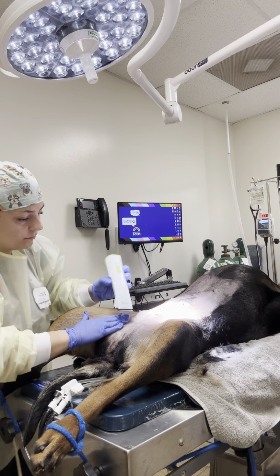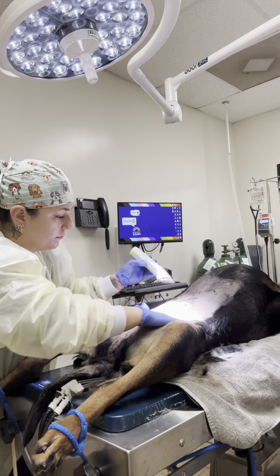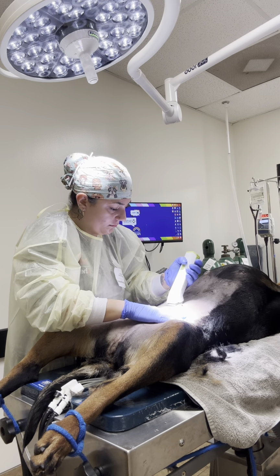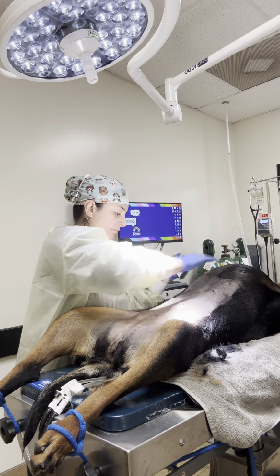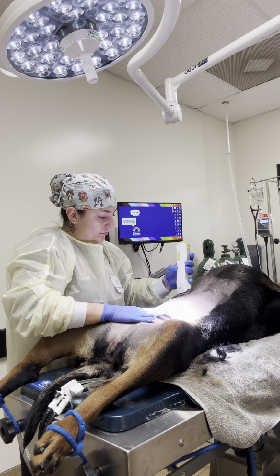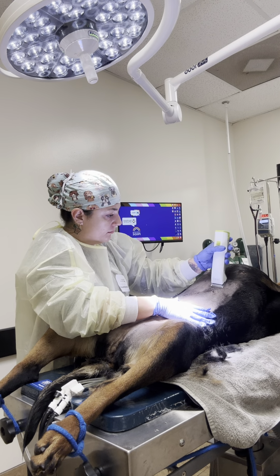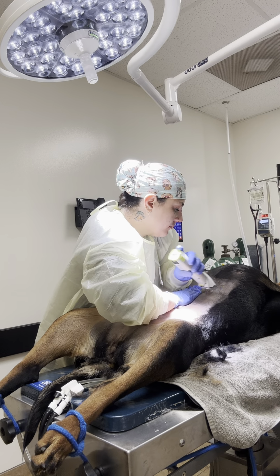So now are you at 1 or at 1.17? I'm at 1.5 right now. Are you administered? Oh. So give 0.2 more to that at 1 point. Okay. That 1.2 more to feel it going. Yeah. And now the worst thing that happens is this syringe will backfill with fluids. Okay. Big deal. You know how much is in there, and you can just give it all to backfill. Okay. But now you've given your initial full 1.17. Yeah. So now we'll see how that works.